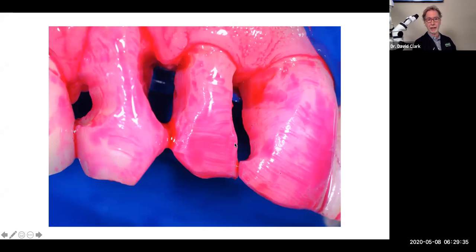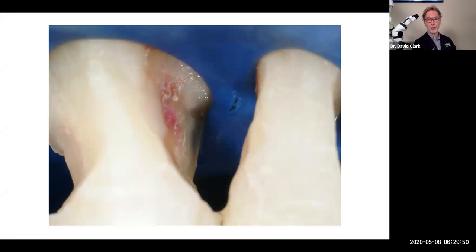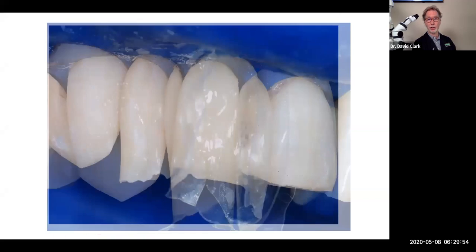There's caries indicator. And the one thing that caries indicator is going to show you here is that I've done selective caries retention. So see that zone right there? That is not pulp. That is the purposeful caries retention. Leave it, leave it, leave it. Shrink wrap the tooth, blast it, sand the contacts, injection overmold the teeth.